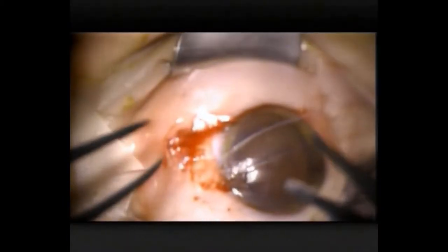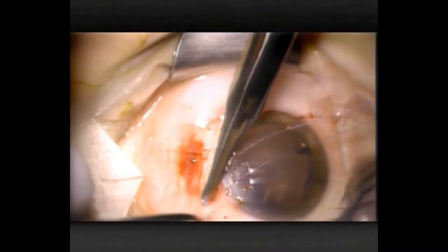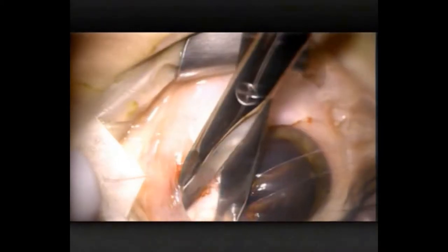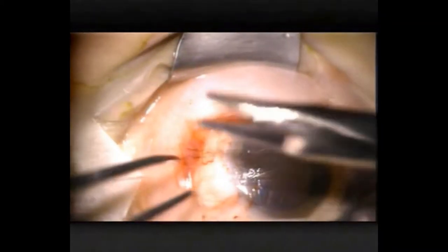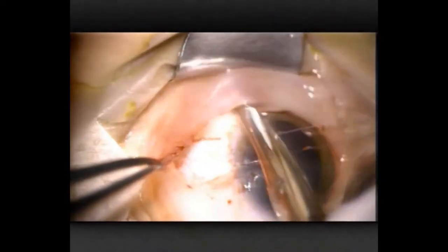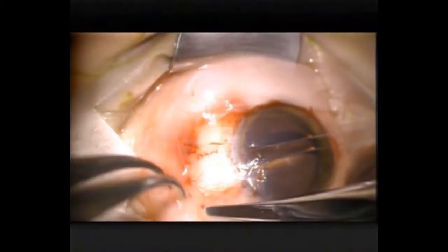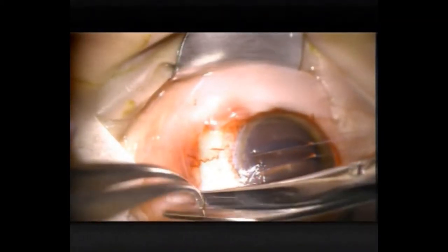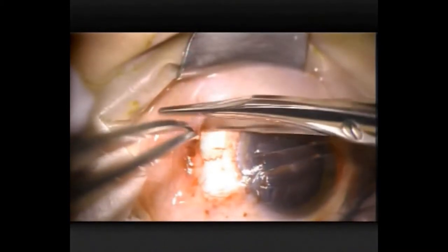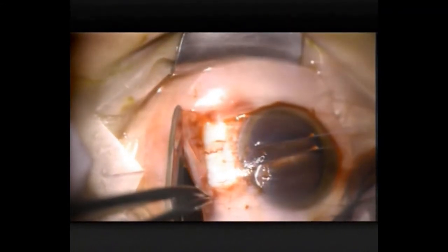Now I've got some temporal traction and I go underneath the conjunctiva here, just pushing and spreading. Then I'm going to remove it. At that point there is where, if you cut, you'll get a lot of bleeding, so I'm always very careful not to cut at the nasal horizontal meridian — it's a big vessel always. Now I'm putting the relaxing incisions in and looking at how much scarred conjunctiva I need to remove, and I'm just slicing that off now.